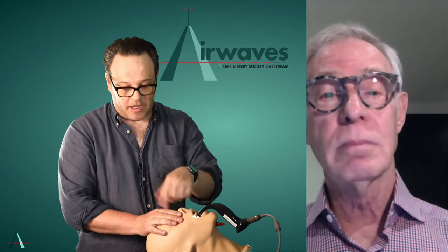But to be honest, I don't personally. I have not found that these devices are essential with this technique that I've described. Yep. I must say, as simple as possible. So I have to agree. I was using a lot of different things before I was shown your technique, and now I go for the stylet. I must say, I tend to use the rigid stylet rather than the malleable one. But I find I have more control.